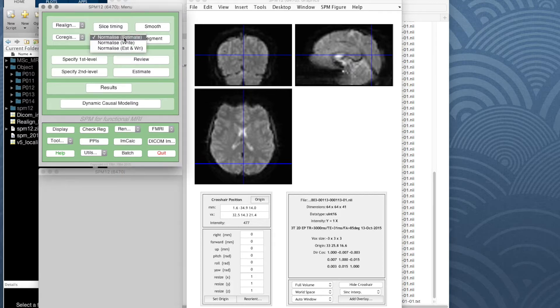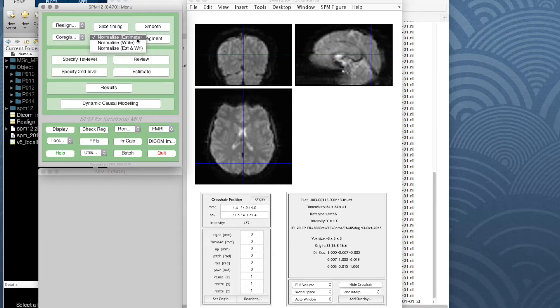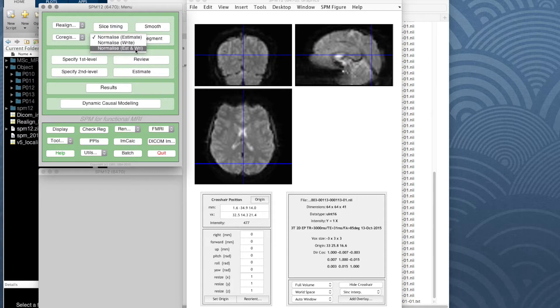In the image pre-processing panel, normalize has three options: normalize estimate, normalize write, and normalize estimate and write together. Normalize estimate just works out the warping parameters to change one image to match another, and the writing step creates a new image that is warped. We're going to use the third option to do both together: normalize estimate and write.